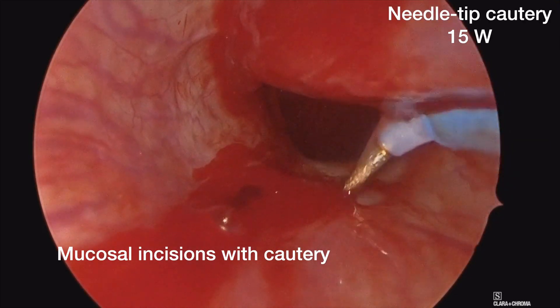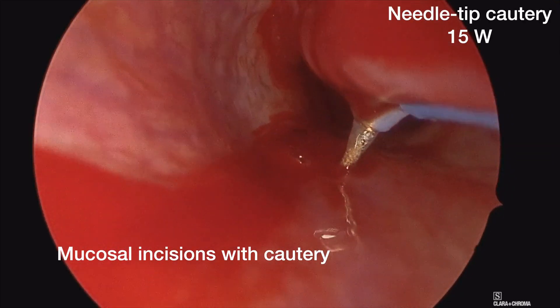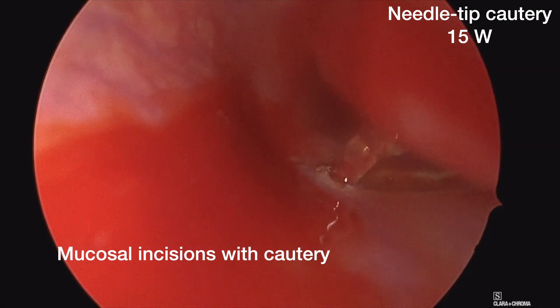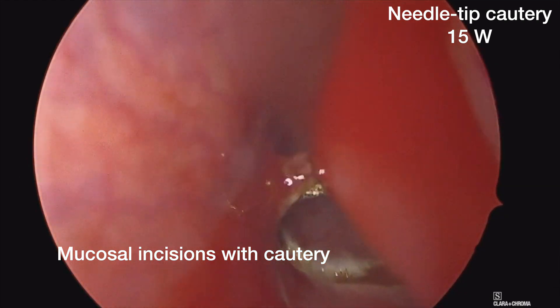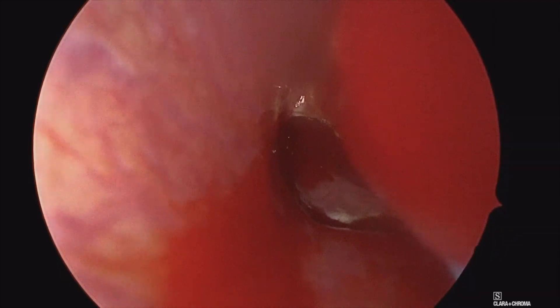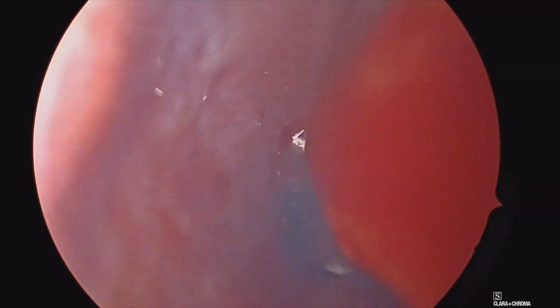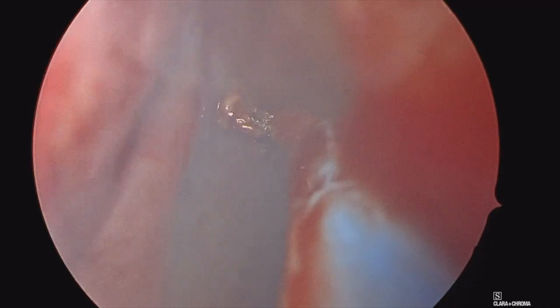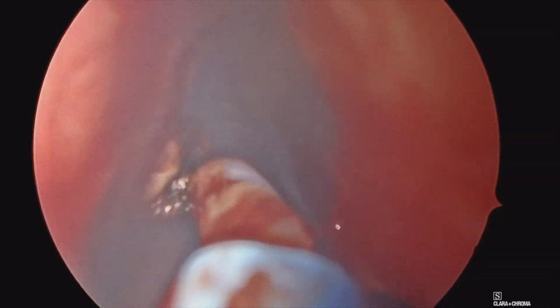We harvest these fairly widely and use them quite commonly. Here we are making a posterior incision at the junction of the hard and soft palates with a needle tip bovie cautery on a setting of 15, with that needle tip turned approximately 90 degrees. I usually do that with a needle driver. The key part there is palpating that soft-hard palate junction, making sure you're on the hard palate.